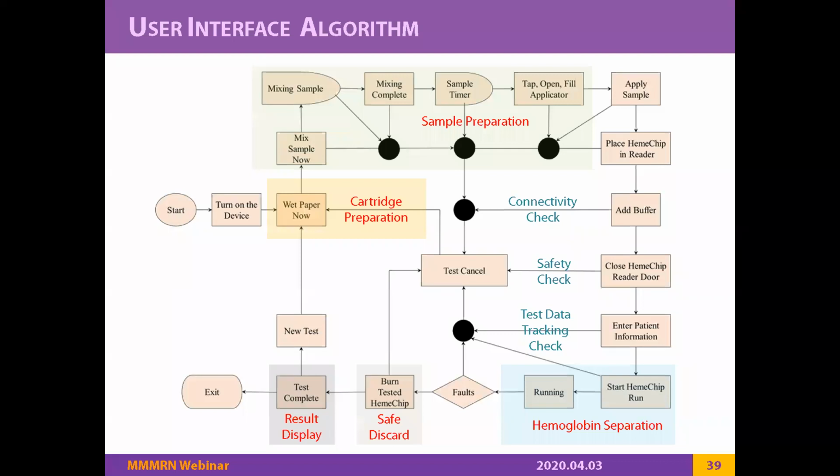When you say previous model, if I understood the question correctly, there was no previous point of care testing based on electrophoresis. There are a lot of point of care devices for different diseases, and it's a $1 billion industry. So the idea of miniaturization of medical devices is nothing new. The novelty of our system is that we took a very low cost system that's not considered a highly reliable system. We made it reliable, portable, and rapid. So we shouldn't claim that we developed the electrophoresis system. We made it a point of care system that is reliable and rapid. Does that answer the question?